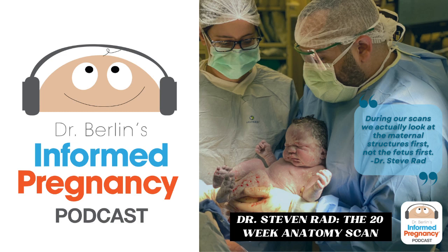For example, if you're doing a C-section, if it's anterior you want to know whether you're going through it to get to the baby, or if it's posterior, just for delivering and surgical purposes. But otherwise, it doesn't really matter. So it's just collecting a data point. Yes, it helps the delivering obstetrician, and helps if someone's scanning in the future to know where to look.